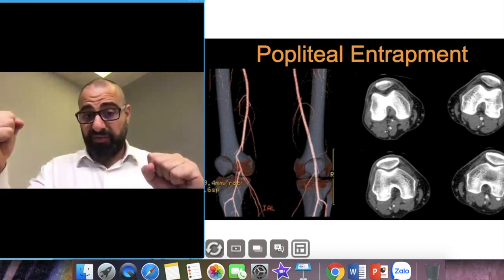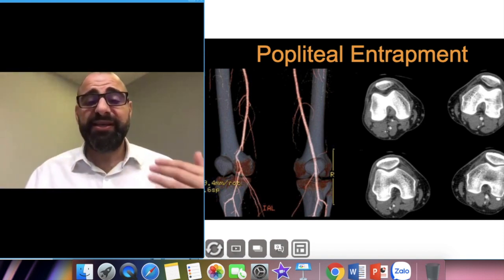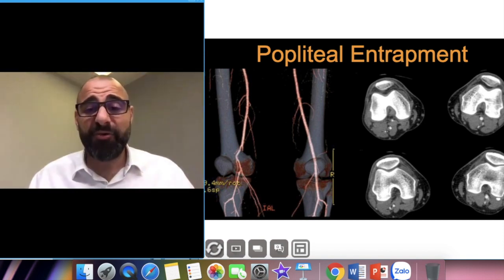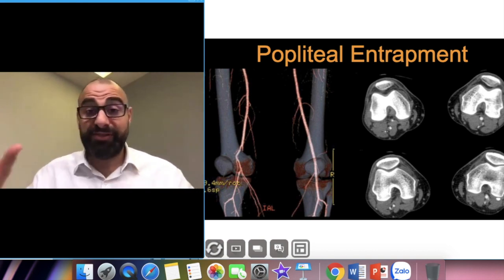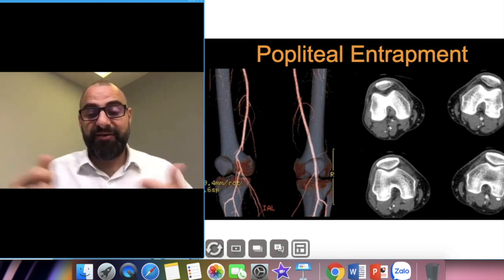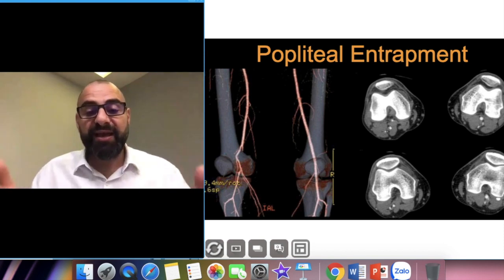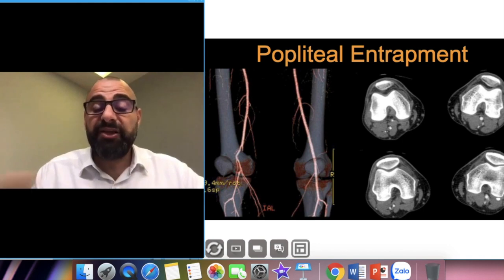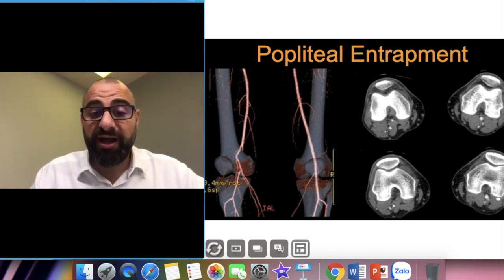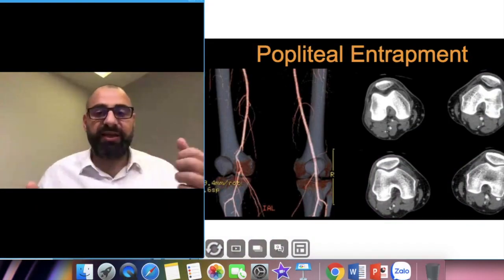Young people and athletes have popliteal entrapment, where a ligament crosses posteriorly and compresses the vessel, causing reduced flow to the lower leg. When we monitored at the popliteal fossa we saw both vessels fill with contrast nicely, with good flow going down. Looking at the image on the right — the patient's right leg — you can actually see the vessel coming off at an angle where the ligament has compressed it.